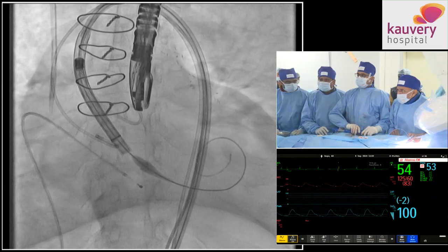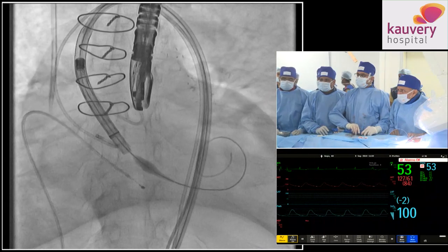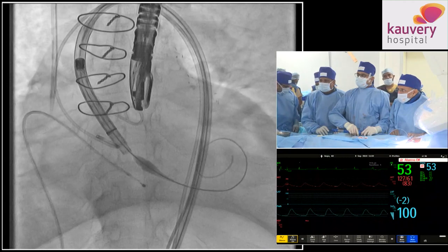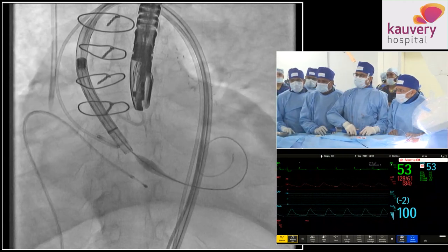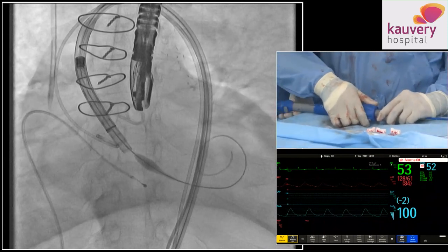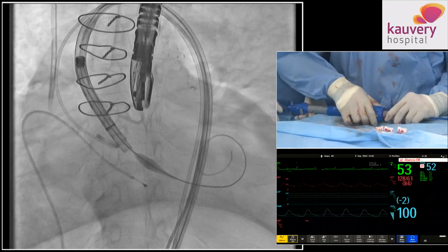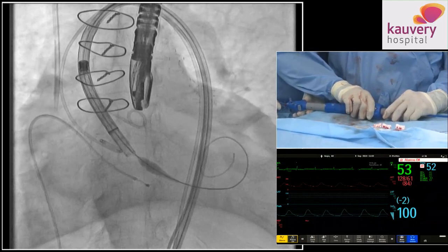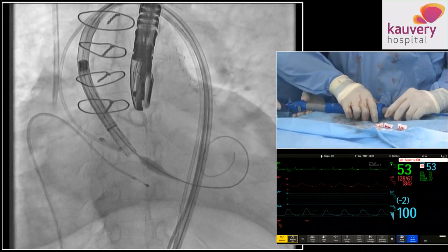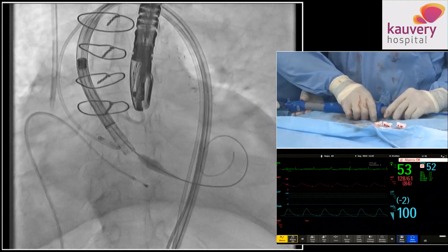Okay, now. Okay. Slow. Back a bit. A bit higher. Yeah, okay, fine. Slow. Just give it some time. Yeah. Just wait for the tension to get out. Yeah. Very slow. That's good. I like the higher up being slow. I'll adjust. Yeah. Slow. Just hold. Just pull a bit slightly. Hold. Let's wait for the release. Tension to come down. Yeah. Okay.